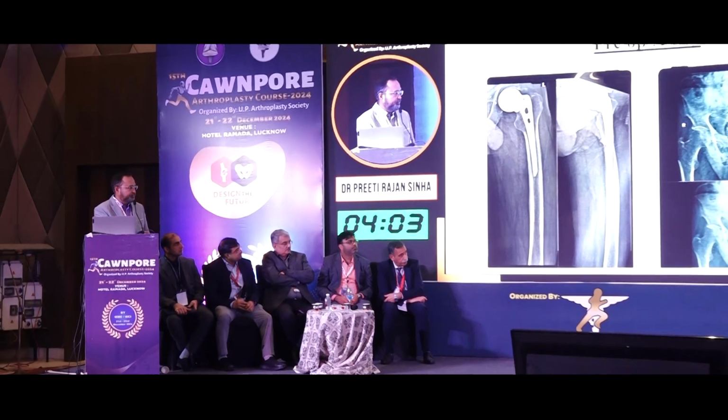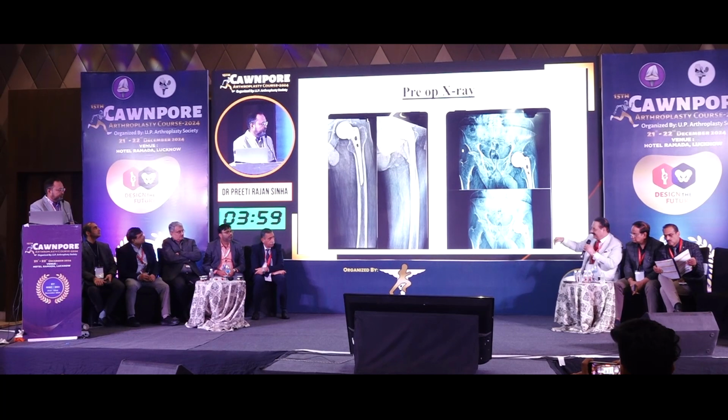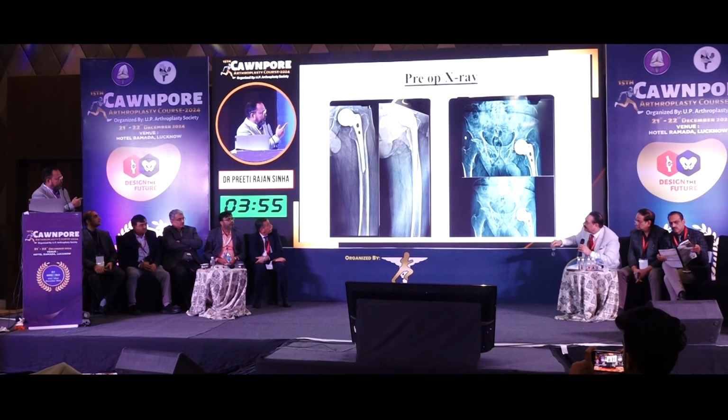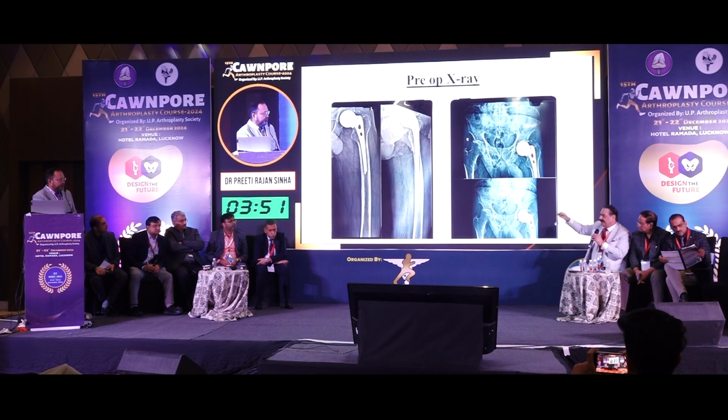Yes, sir. So step one, rule out infection. It was painful since the very beginning, no matter how it looks, because we all tend to give a lot of antibiotics. It might be a grumbling infection. This is the pre-op X-ray when the patient came in OPD. Yes, I understand. So an 18-month-old hemiarthroplasty which has been painful from day one. The approach would be to rule out infection and revise.